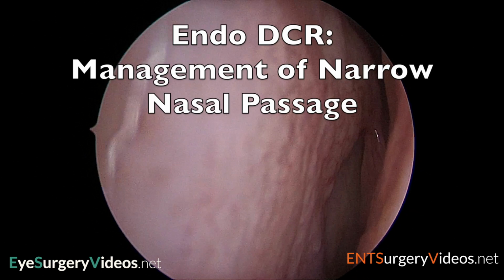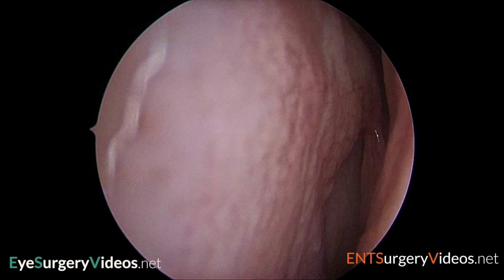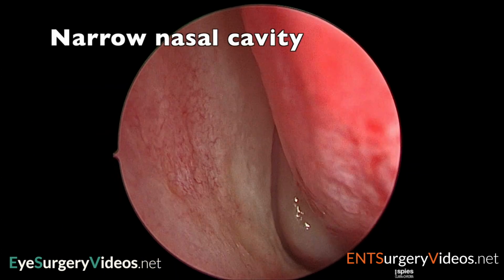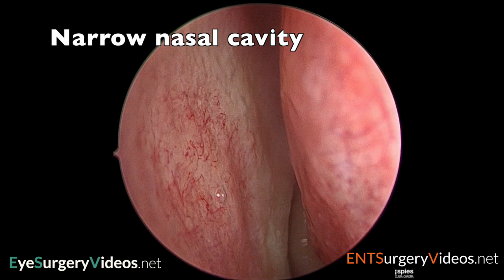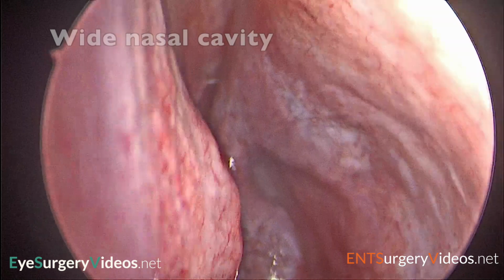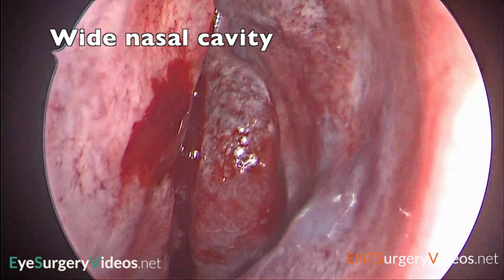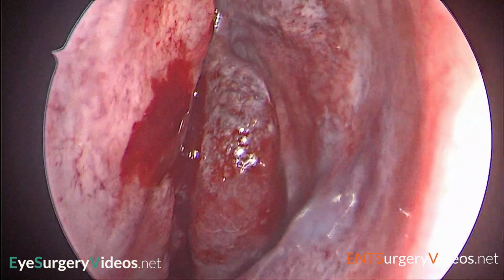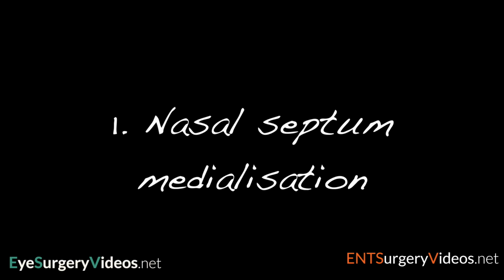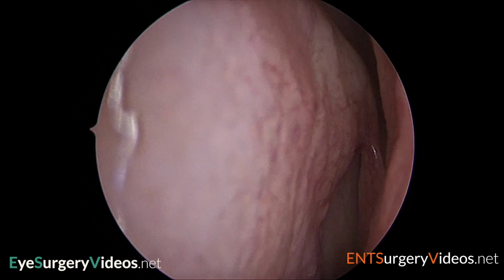Endoscopic DCR is more challenging when the nasal cavity is narrow and access to the lacrimal region is impeded. This nasal cavity has a deviation in the upper nasal septum, which obscures the view of much of the middle turbinate. In comparison, this patient's nasal cavity is much wider, and the whole middle turbinate and the maxillary line can be seen.